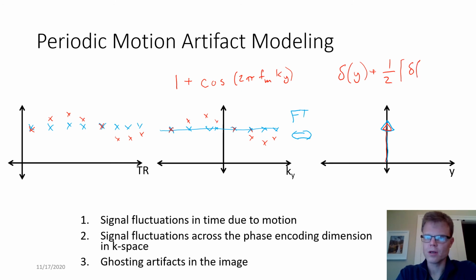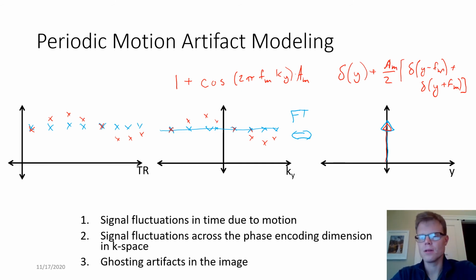So recall that the Fourier transform of a cosine is, and let's add a scaling factor here too, because it's usually not going to be the same size, right? It's some smaller oscillation on top of a bigger signal. And we could easily put a sine in here. It's just going to change the real and imaginary components of this.